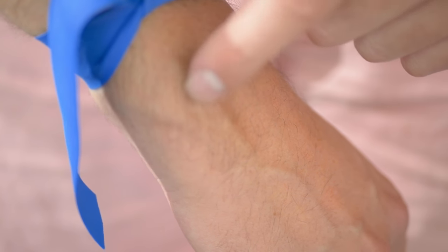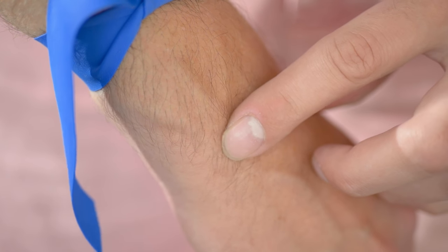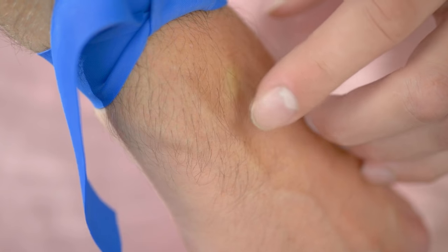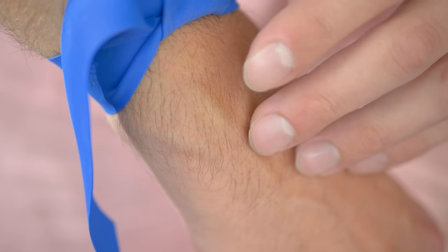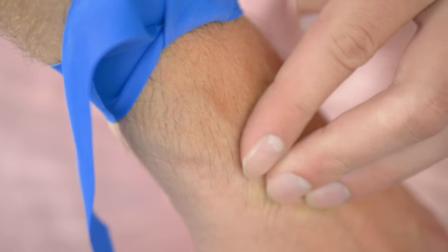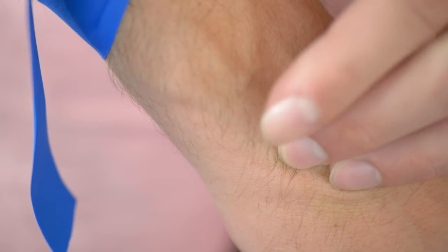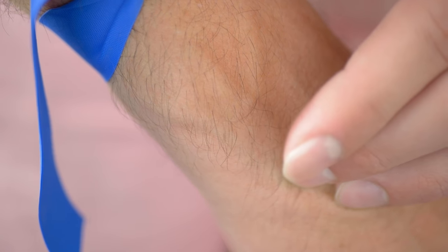Looking more specifically at the hand, notice what's happening with some of these veins — it almost looks like a Y shape. There's one vein at the bottom that's the base of the Y, and then two at the top. Where all those veins meet each other is called a bifurcation. I'm doing valve testing here — holding a piece distal to the vein and pushing the blood through. If it flows all the way back when I let go, there shouldn't be a valve; if it doesn't flow back, there might be one.